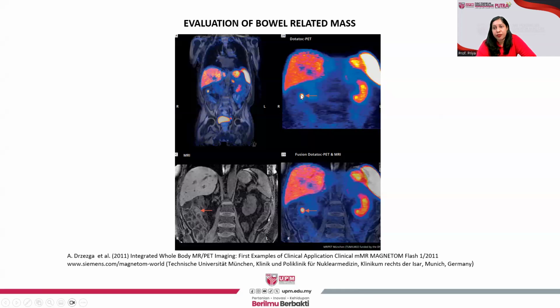So if we just depended on a PET image, these lesions are typically difficult to localize on a CT scan. However, on MR imaging, excellent soft tissue demarcation is noted, with good correlation on the PET-MR acquisition that localizes the tracer uptake to the lesion in the terminal ileum.